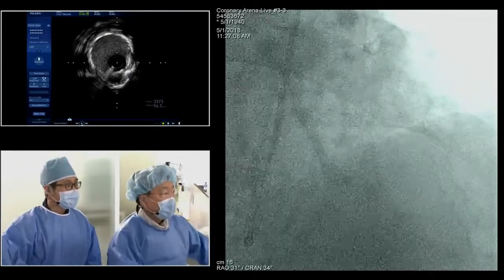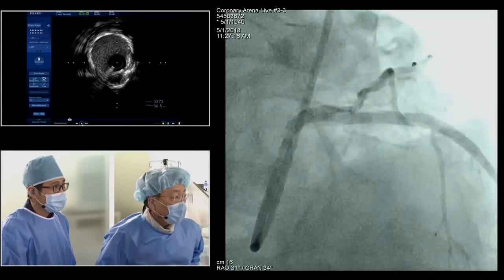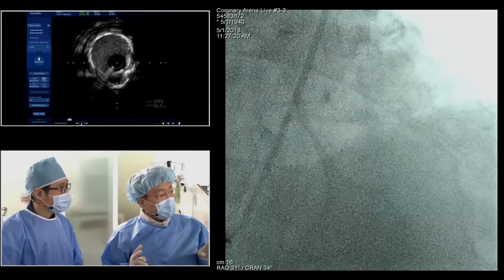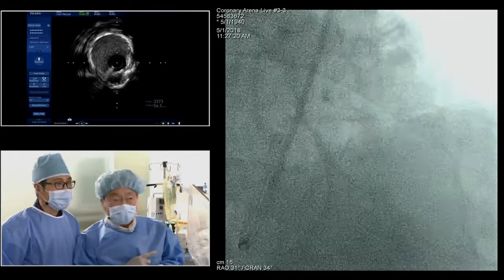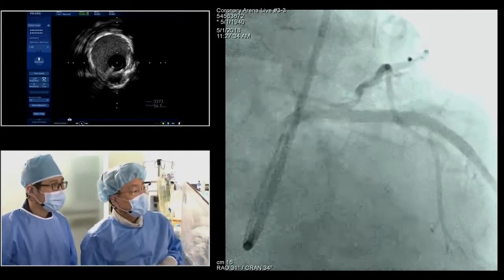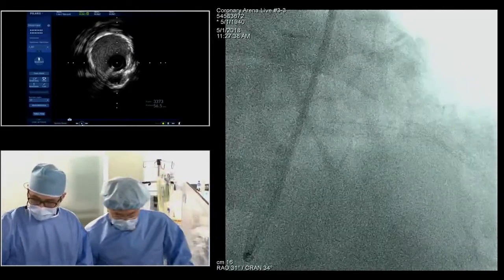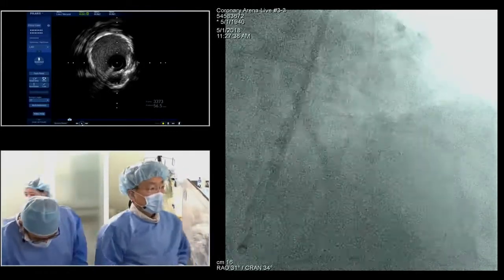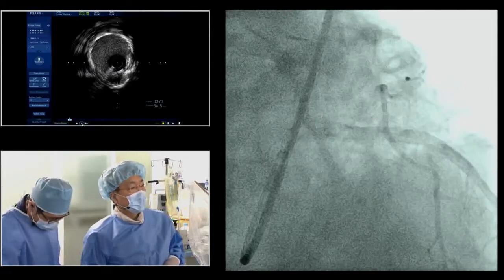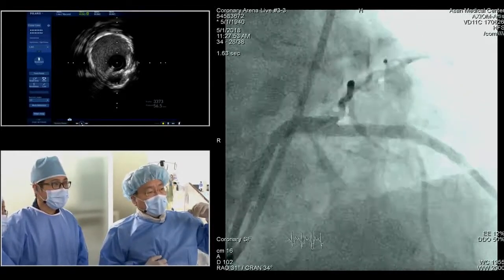ready. All right. I explained what we've done so far. So I want to take a picture and then explain what we have done. Okay. So after the two stent placement, would you show that? Take a picture. All right. Okay. This is immediately after the two stents and high pressure inflation.